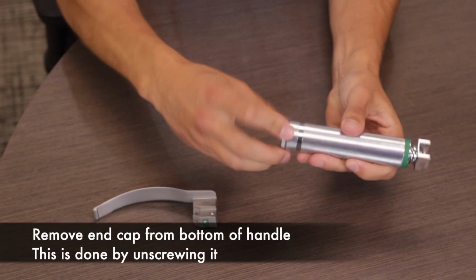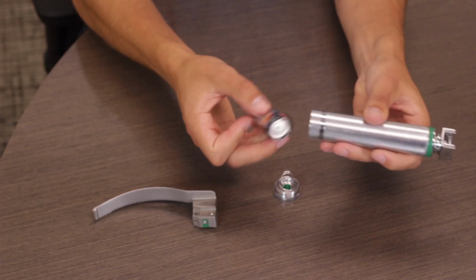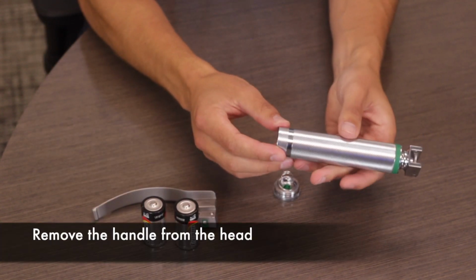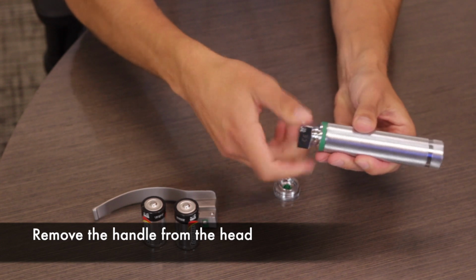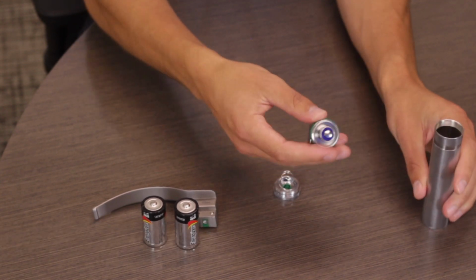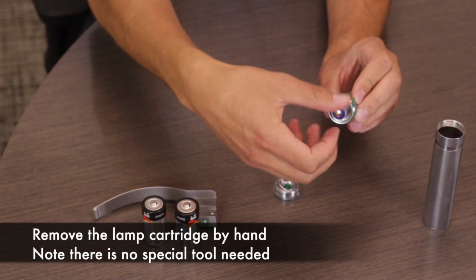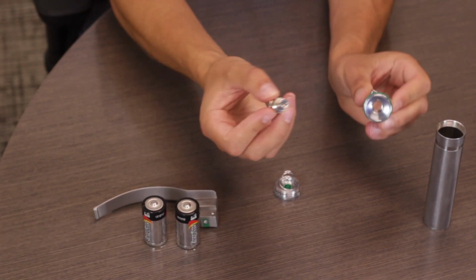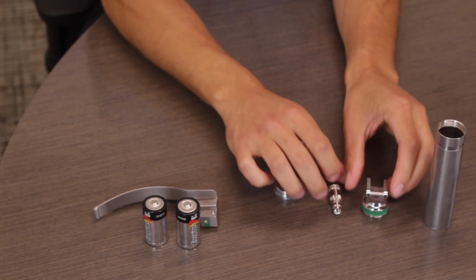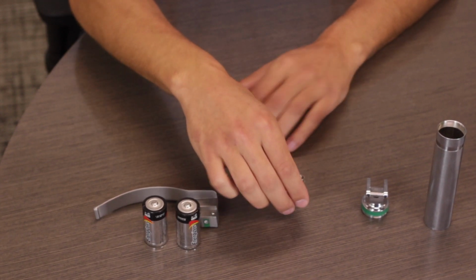Next, simply unscrew the bottom portion of the laryngoscope handle and remove both C batteries. Once the batteries have been removed, unscrew the laryngoscope handle head. Inside of it you'll find the lamp cartridge. This lamp cartridge can also be unscrewed by hand. Note that no special tool is needed to remove the lamp cartridge. Once the device has been completely disassembled, it is ready for cleaning and sterilization.